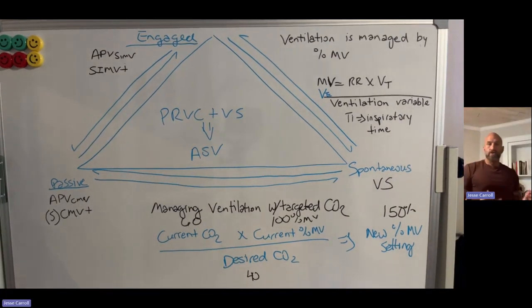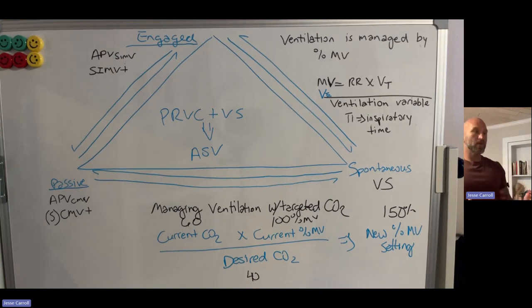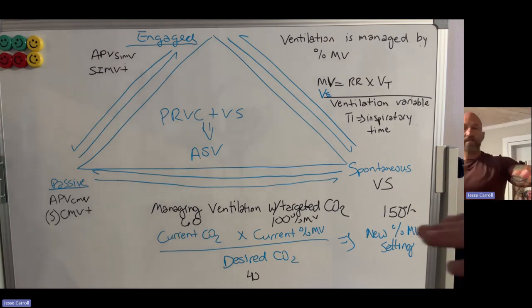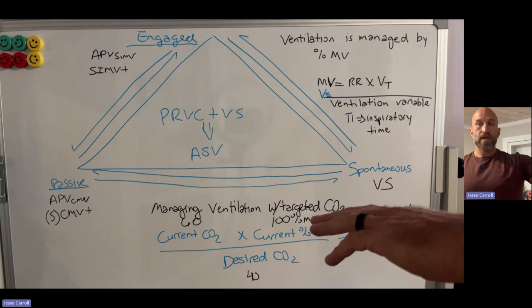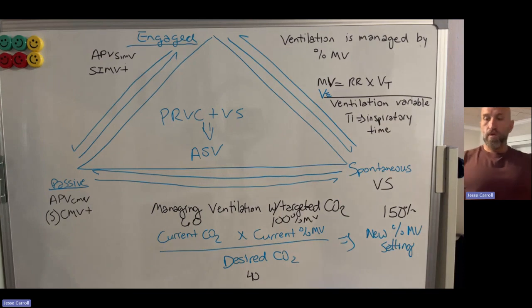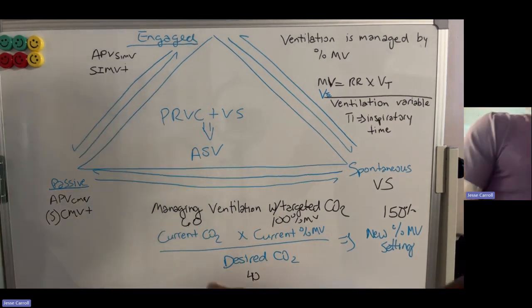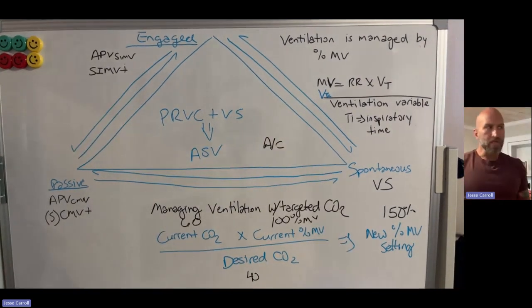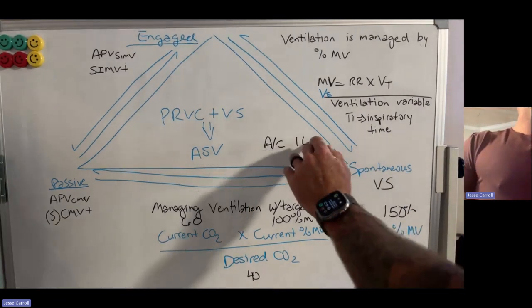Titrating to a target CO2 helps my rescuer to make much quicker and more informed decisions based on true clinical data that will produce actionable results instead of delaying the onset. For example, in this same scenario, let's say they saw the CO2 of 60 and they were on some form of conventional ventilation, call it AC, and they had a respiratory rate of 16.